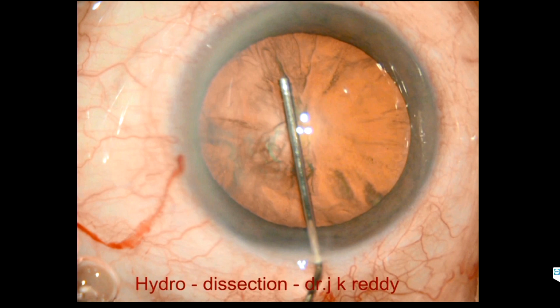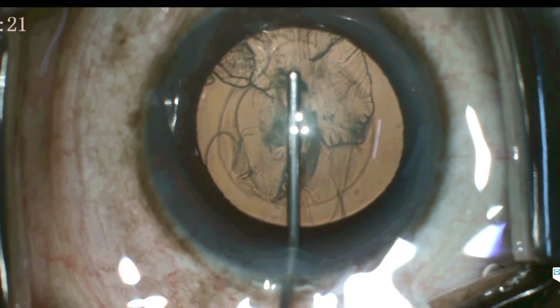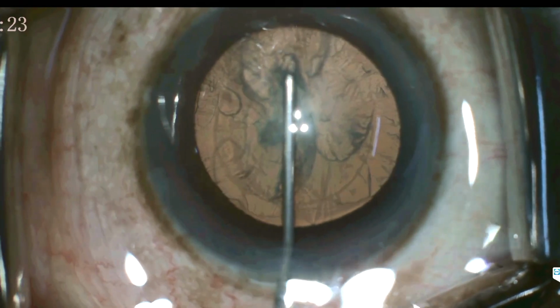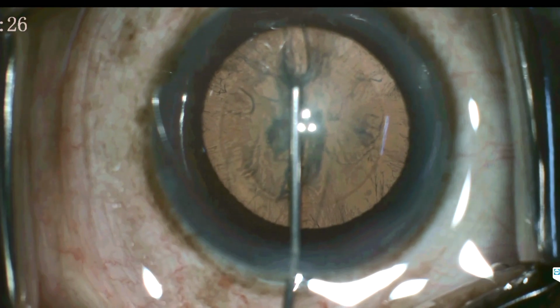So I stop with hydrodissection. Even in our institution, none of us will do delineation and no golden rings. Just do hydrodissection and leave it. Cortical cleaving hydrodissection, that's all. You don't need to go under the capsule, just stay 2 millimeters from the capsule, release the fluid jet, just inject, and it will get dissected. You don't need to do it like the textbook description, go under the capsule and lift. No need. Just inject the fluid onto the capsule junction, it will happen.